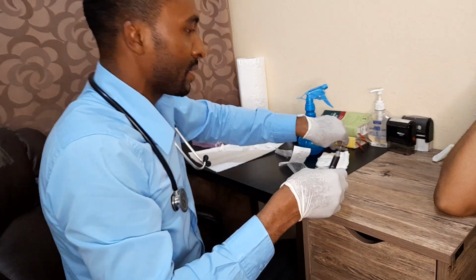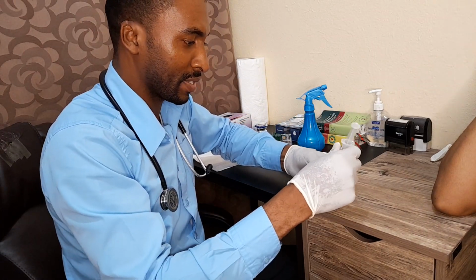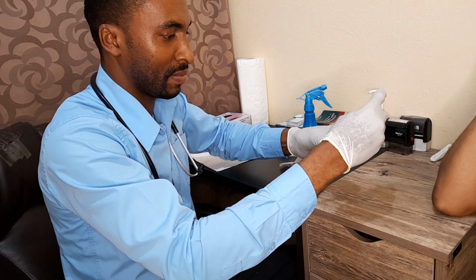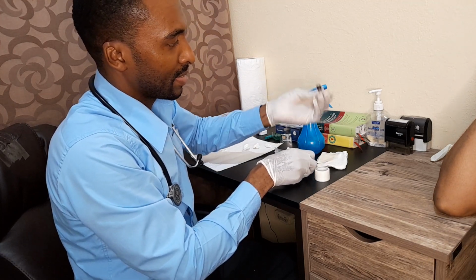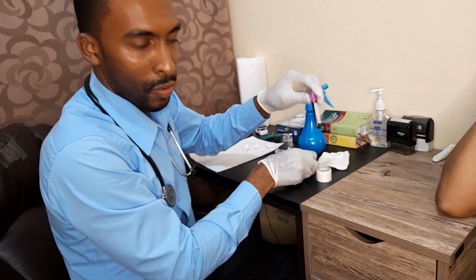But just to know that when we're taking a CBC sample, we have to agitate the sample a little, because we don't want a clotted sample. We need a sample that's not clotted, because it's the red cells, the platelets and the white cells we want. So we don't need the serum, we need the full whole blood itself.